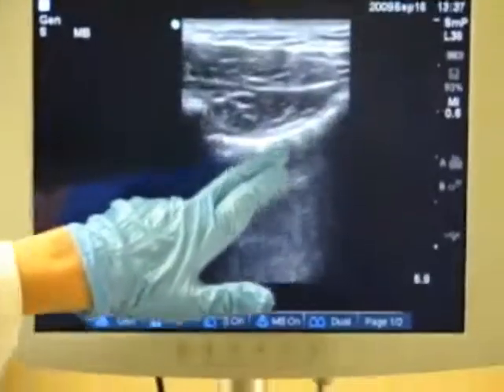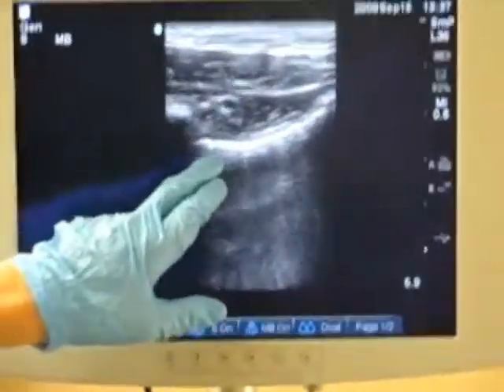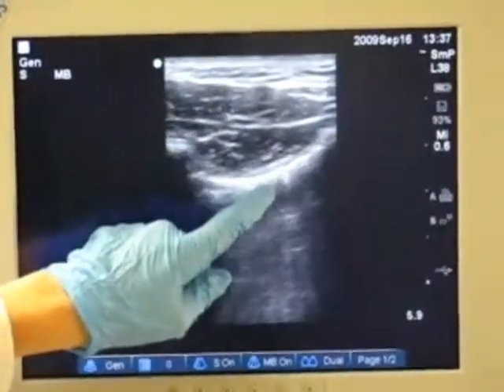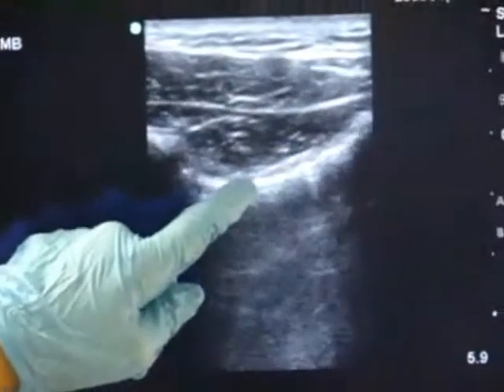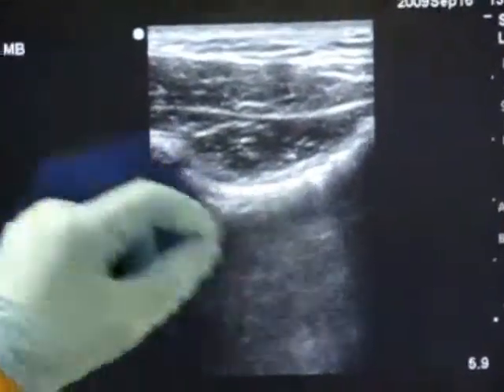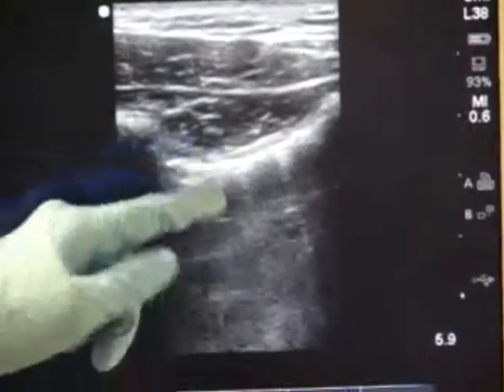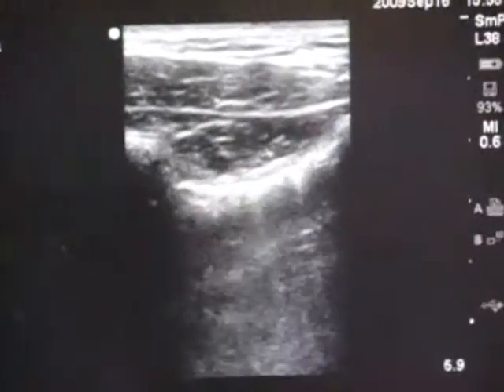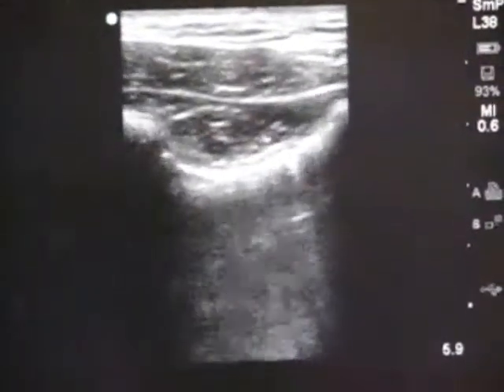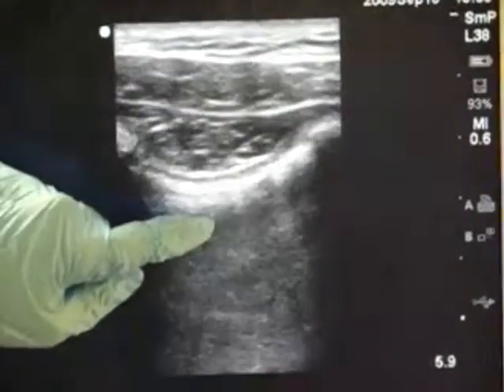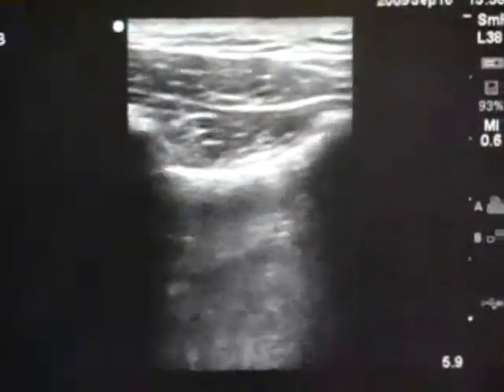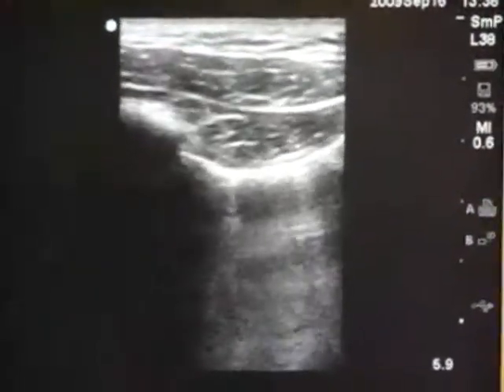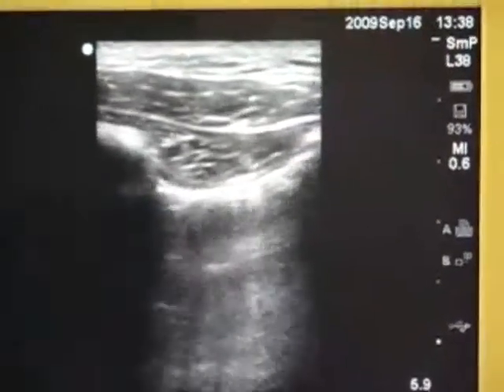When the pleural line is being evaluated, a normal pleural interface shows two aspects. One is lung sliding, which can be seen with slight movement of the visceral and the parietal pleura on each other — seen as almost like ants walking along this bright white line. The other finding of normal lungs is that of comet tailing, seen as bright white lines shining down, which is an artifact caused by the visceral and the parietal pleura rubbing on each other, and that is normal lung.